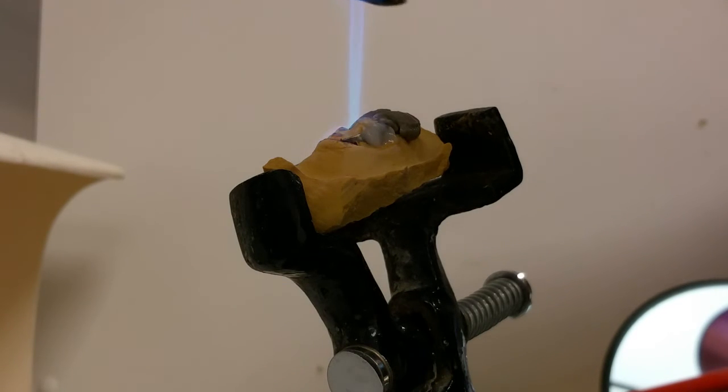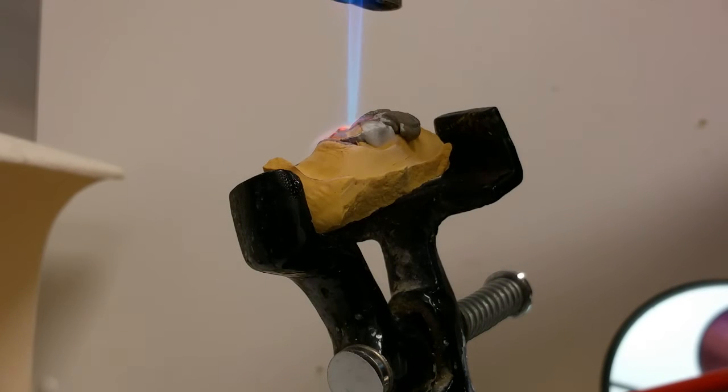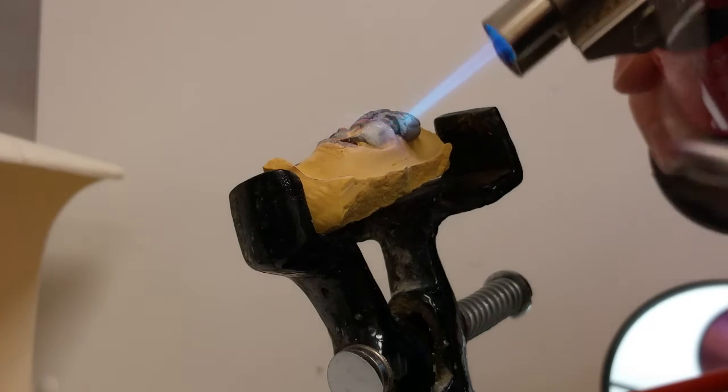The BTUs stay the same, but the heat gets knocked down on the wire. Kind of protects the wire. Actually puts a layer of oxidation or whatever around the solder joint.